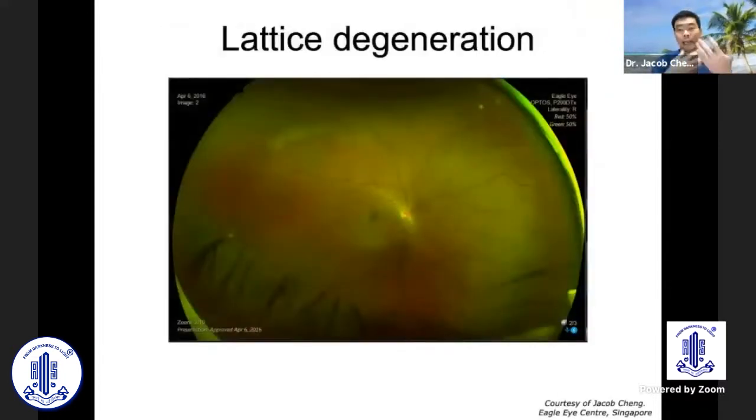So this case would be both instructive as well as, in this day and age of medicolegal prevalence, a reminder that we need to document that we have actually counseled the patients with photographs, but however, patients may wish to delay treatment and subsequently develop complications. It's also important to document the opposite eye, which shows some lattice degeneration that predisposes the patient to retinal detachment, as the earlier speaker has also mentioned.